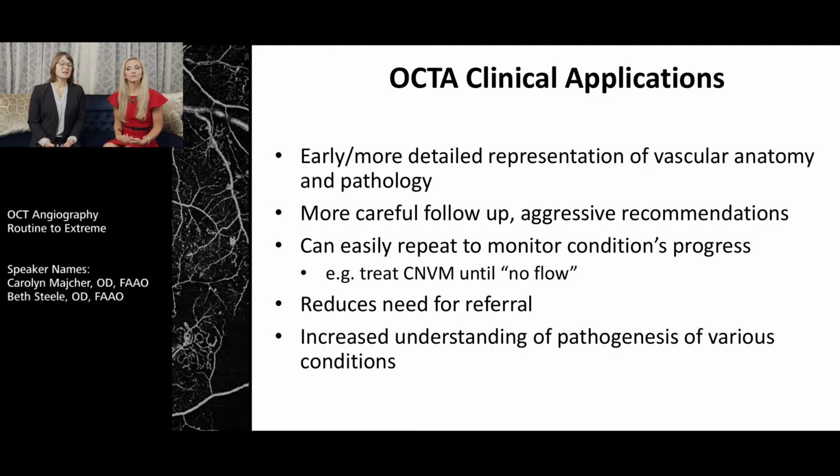It may reduce the need for a referral because in many cases where we were relying on the dye-based angiograms to confirm or deny the presence of a leakage or a membrane, for example, or macular edema, we may not necessarily need that anymore. In many cases, it's going to reduce the need for that extra trip for the patient.